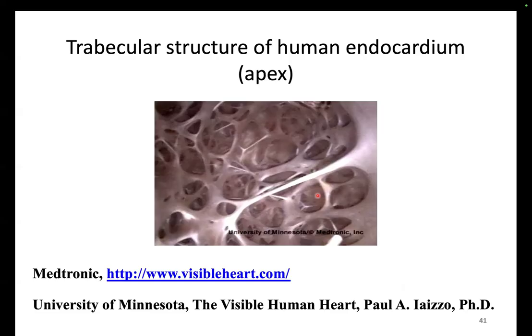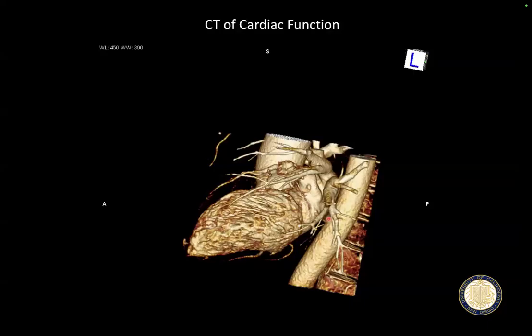Nowadays, you do see it on MR if you pay attention to try and image it. But with CT, this detail is absolutely visible. So you get all of these indentations because the voxels are small enough that you can actually render these indentations.